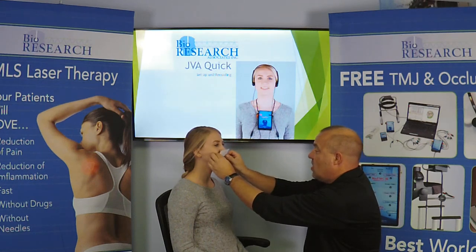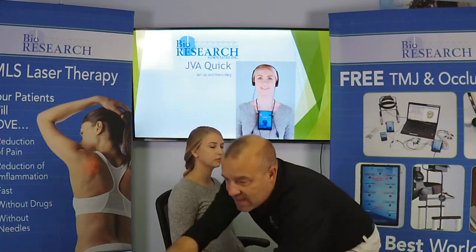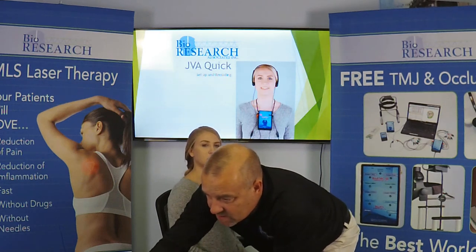Okay, now slide your jaw all the way to the right. And that is 11 millimeters back to center. And all the way to the left. And that is about 12 millimeters. Very good. So 11 to the right, 12 to the left. We can enter that. So here for the left, we'll put 12. For the right, we'll put 11.